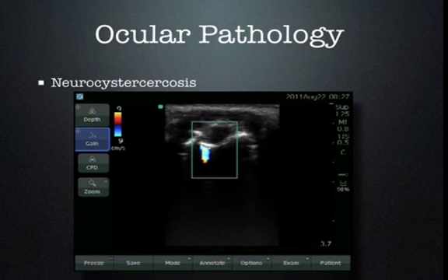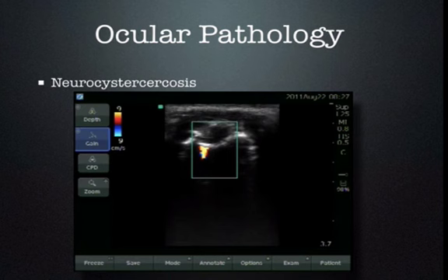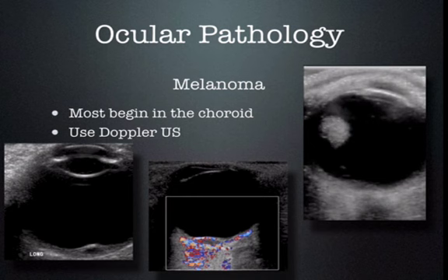Another thing that may be encountered in some parts of the world is neurocysticercosis, and we can see this in the eye. Generally, this causes massive calcification — here we have the twinkling artifact showing calcification, with posterior shadowing that is very deep and very dense, filling the eye. This is not the same as the calcification seen with retinoblastoma — this is much more dense and much more filling.